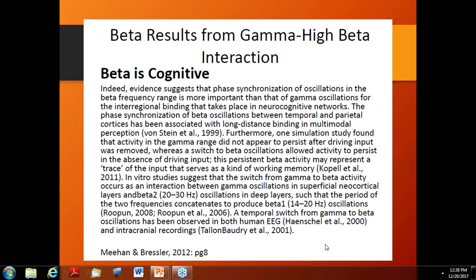But prior to that, from what we've seen in the maps and the analysis and what I've reported and published, you're most likely to see beta asymmetry and alpha deficits, more likely beta asymmetry initially when people are getting fearful and worrying a lot.